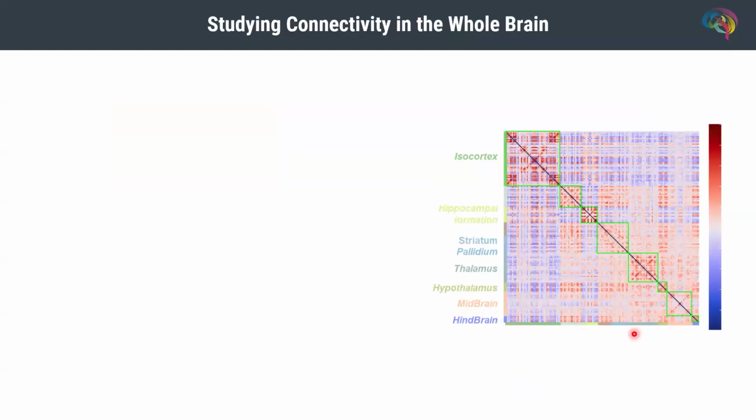Now, all the examples that I just showed were performed in a 2D plane using 2D linear arrays to send the wave to the brain, and we can move across different slices to acquire volumes of the brain. But these procedures tend to be slow and not well adapted for the study of large and sparse brain networks.